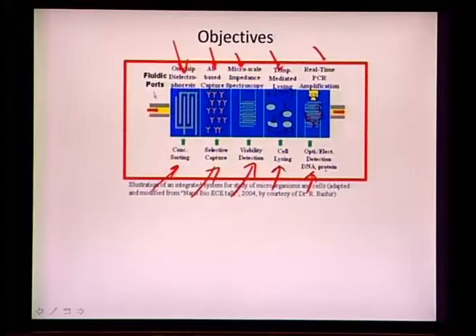For example, the growth based test is used to indicate the viability of a particular cell. The antibody based recognition is essentially upon the cell type. The PCR based recognition is the molecular identification and a stronger finding of what type of species is there in a sample of interest or an analyte of interest. So, nobody has really looked at the combination of all these processes.